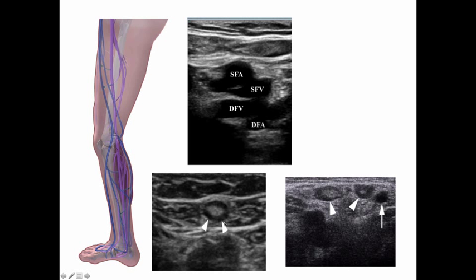So this is sort of a trick question, but what is this here that we're looking at? So great, I was hoping you would say clot, but in fact it's not. Actually what we're looking at here is lymph nodes.